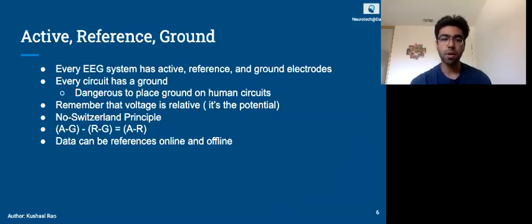And so in an EEG system, when a voltage is measured between two electrodes, one of them must be connected to the ground circuit. But if we connect the ground to the earth, like in normal circuits, the voltage would reflect any surplus charge that's built up in the subject, and that static electricity would basically overpower the neural signals, because the signals from our brain are so subtle, they would basically be lost in all of that.